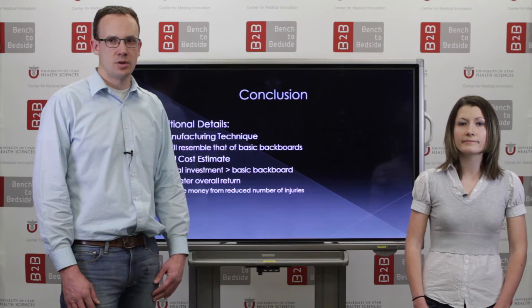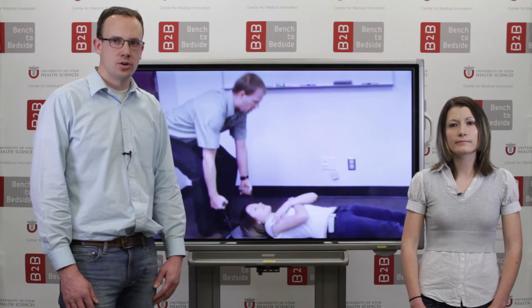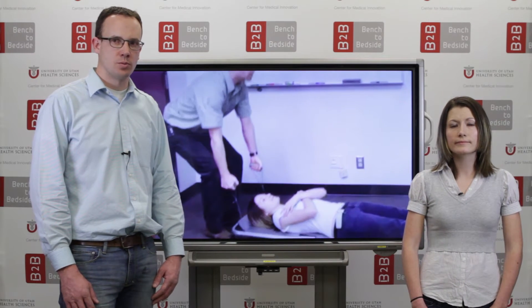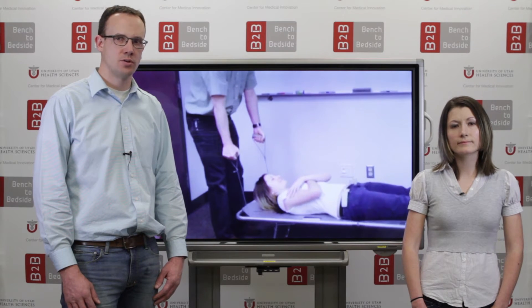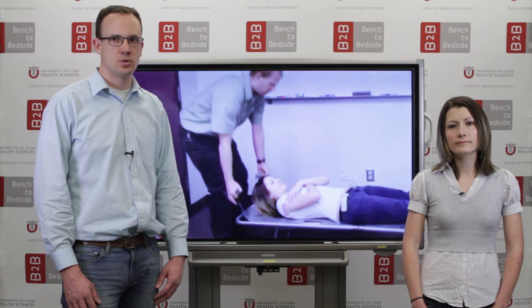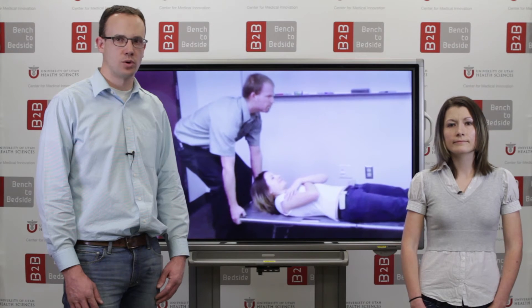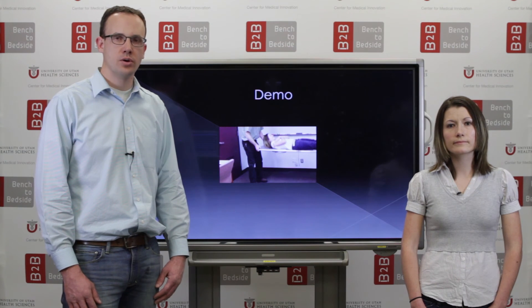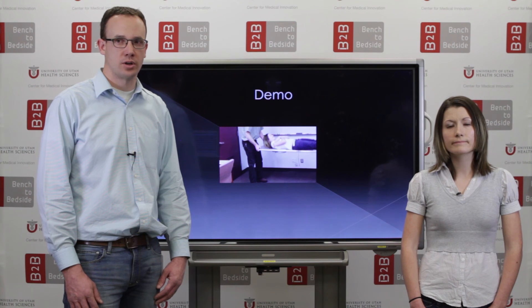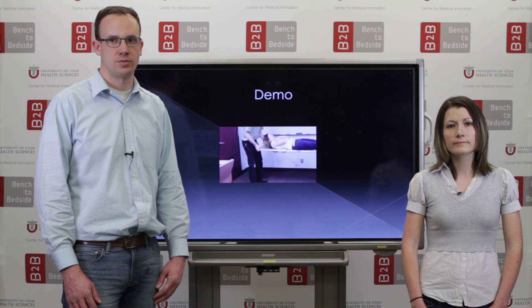We wanted to show you a video that demonstrates how the VETA Board works. With the patient secure on the board, the first lift is performed with the cable handles. This raises the board and extends the legs, leaving the entire system at a comfortable height for the second lift. The second step is to allow the cord handles to retract so the emergency medical workers can grab the handles on the board for the second lift. When the legs leave the ground, they retract automatically to prepare the board for transportation. We are excited about this product and hope to bring it to market in order to reduce injuries and improve the work environment for emergency medical professionals.